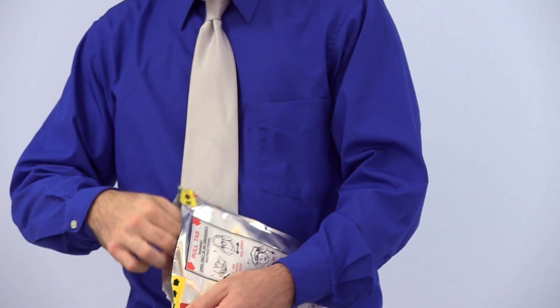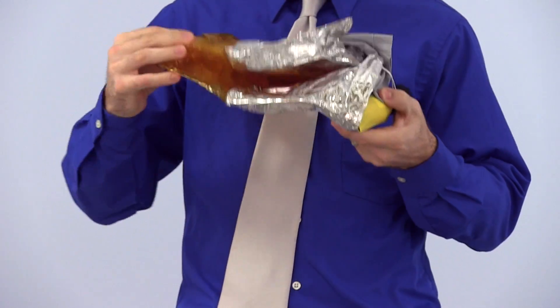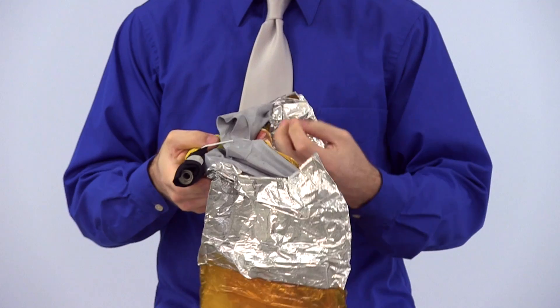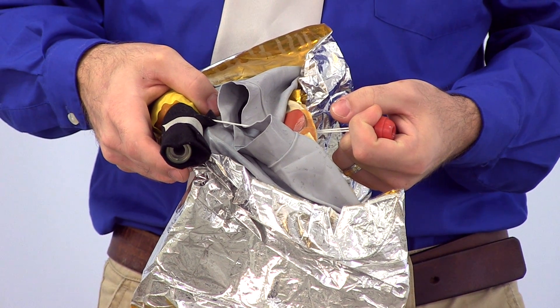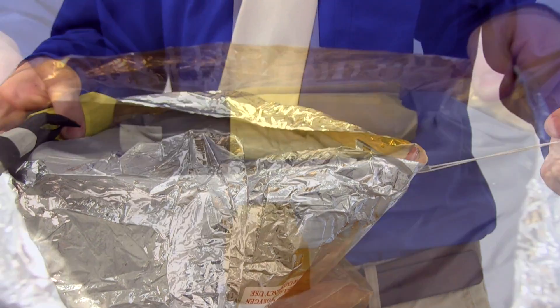Next, remove the hood and unfold. Firmly grasp the oxygen bottle in one hand and the red ball with the other. Quickly pull the red ball to activate the oxygen.